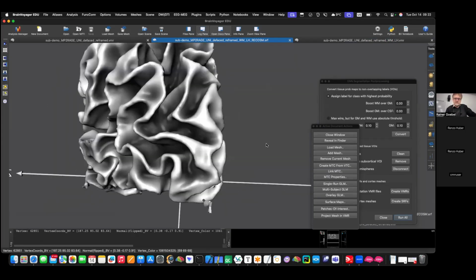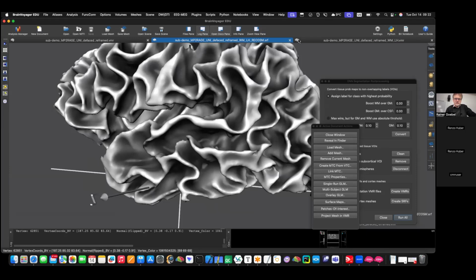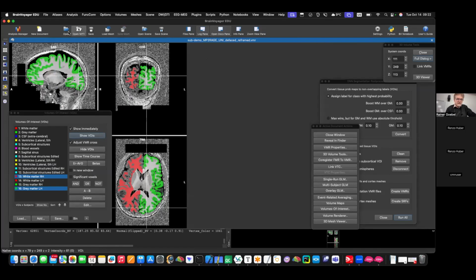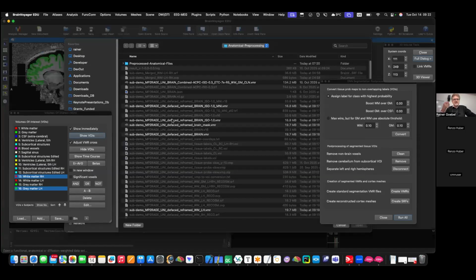Okay, so now I want you to open one file which it also saves, which is called reframed_brain, which is one where it adds the real tissue values, the intensity values, I mean. And this is one we continue working with now, and I also made this available.